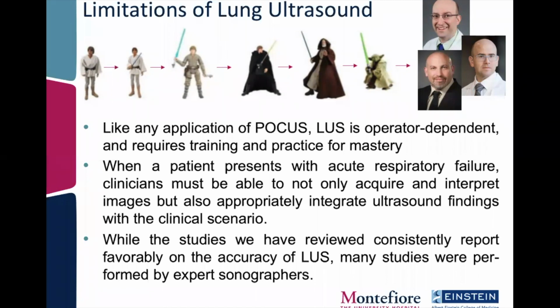I harped on this a little earlier, but when a patient presents with acute respiratory failure, clinicians must be able to not only acquire and interpret images rapidly, they must also be able to integrate these ultrasound findings with the clinical scenario. Over and over again, we found that lung ultrasound is highly sensitive to a lot of different things, but the specificity for any one condition comes when we marry the clinical picture and the scenario together with the ultrasound findings.